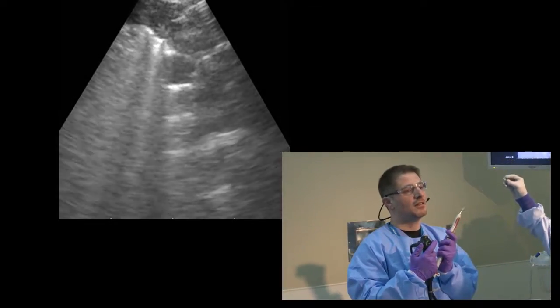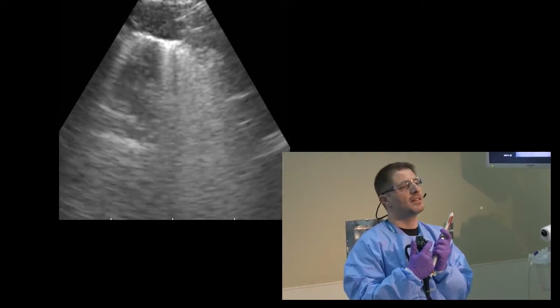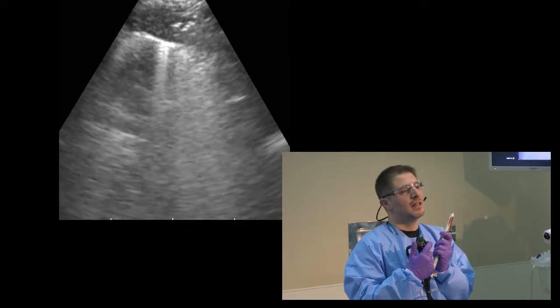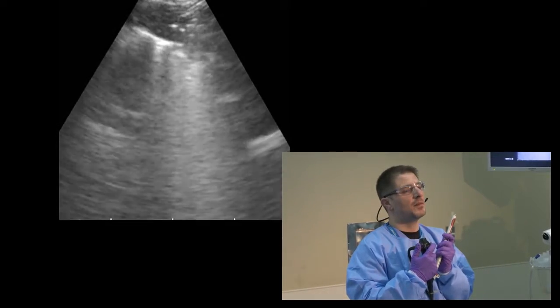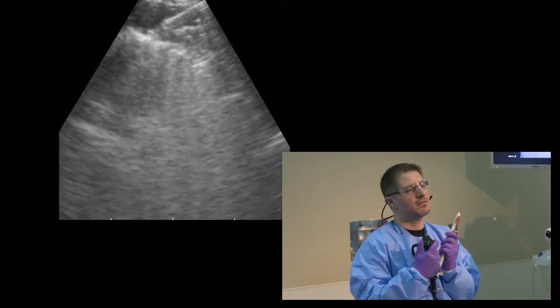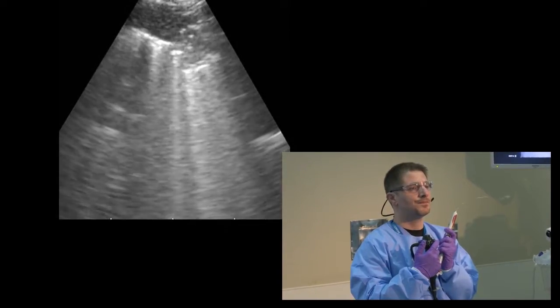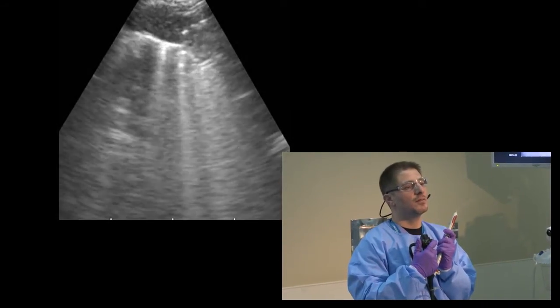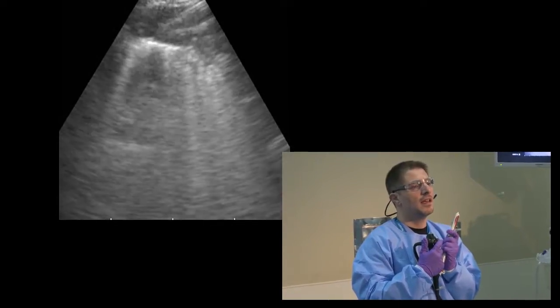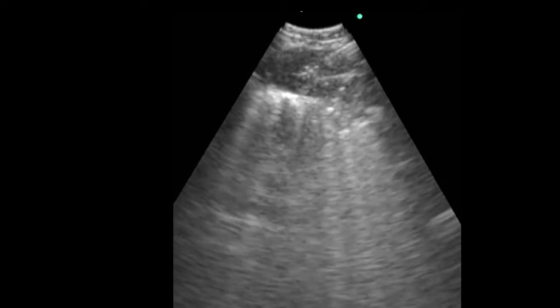Capillary action technique, which is keeping the stylet in, but sampling to guarantee getting sample. And sometimes that can help to get sample with less blood on the smear, which is good for on-site cytological evaluation. As you see, we do multiple passes edge to edge in the lymph node from both borders. And this is to guarantee getting enough sample, about 10 to 20 stabs.